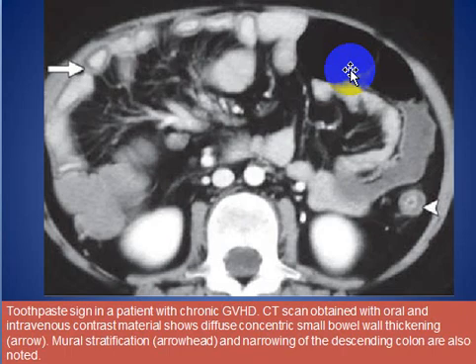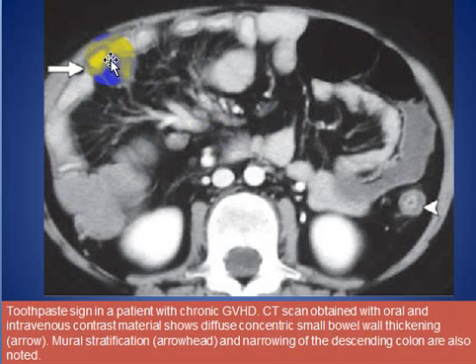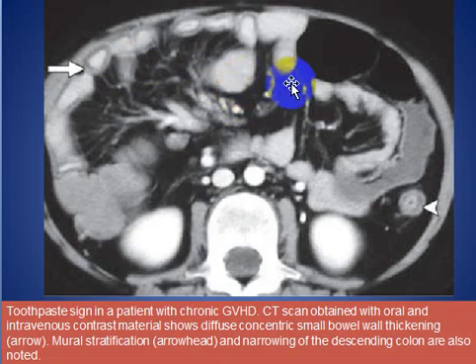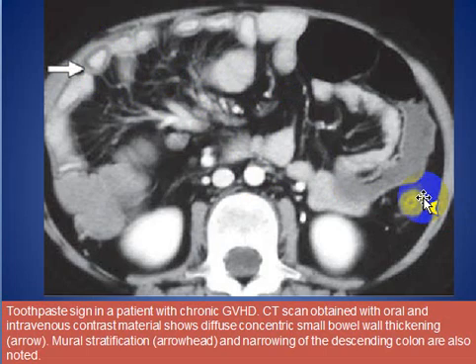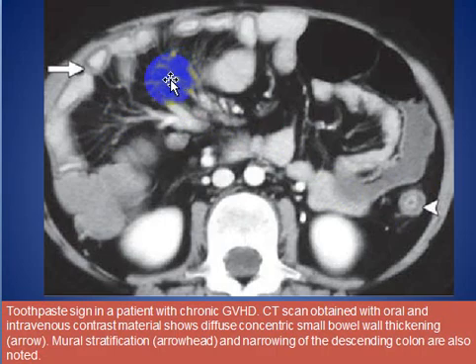Here is another patient with thickening of the small bowel wall — we call this the toothpaste sign — in a patient with chronic graft versus host disease. The CT is obtained after oral and IV contrast. We see the thickened wall here, the target sign, and some stranding of the mesentery.